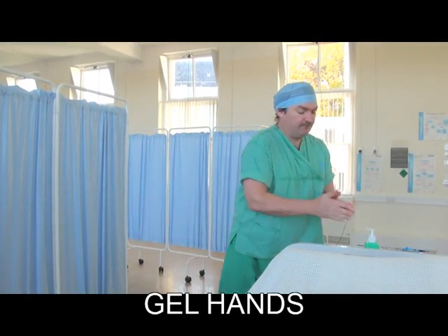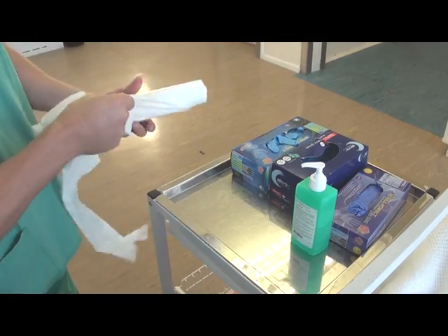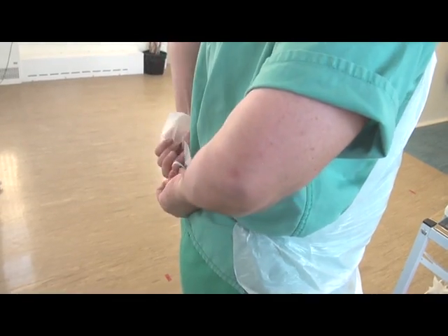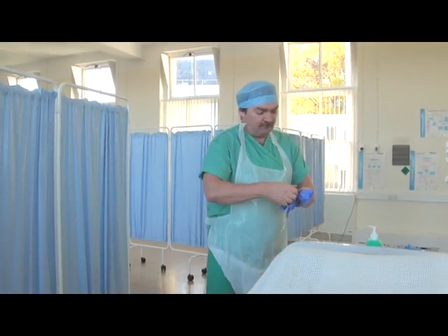Wash your hands before the procedure and ensure that they are dry. Apply a disposable apron and don a pair of well-fitting nitrile gloves.